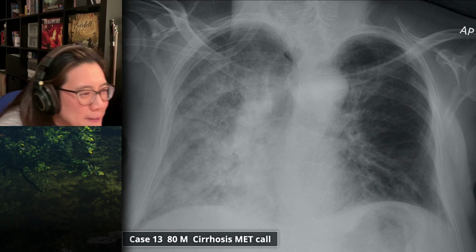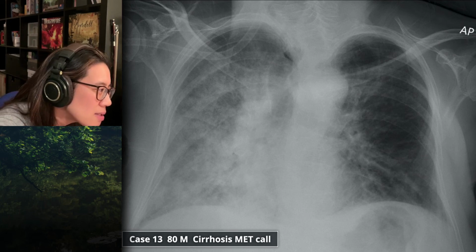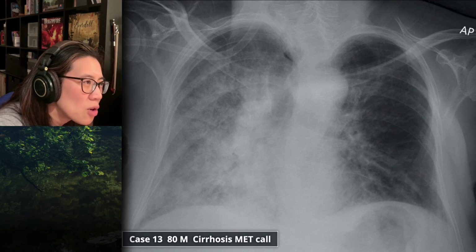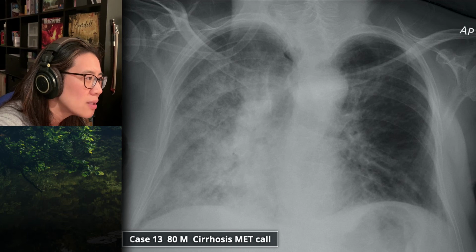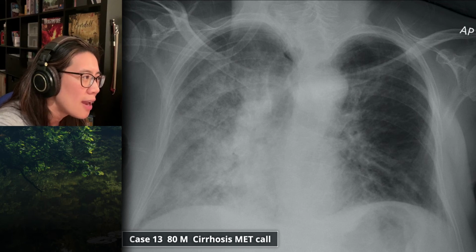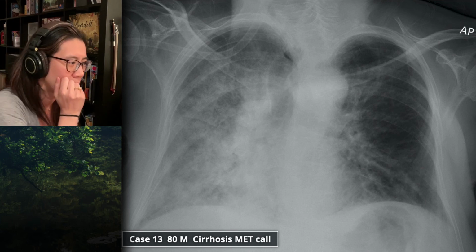Well, maybe I'm making it up. Whereas I can see some air bronchograms in the middle. Yes, there are air bronchograms, and there's no effusion and there's no pneumothorax. So I think this person has left ventricular failure, and I think that the reason why there's asymmetry, I'd want to know how the patient has been cared for. So is the patient lying on one side? So is this pulmonary edema that's come down onto the dependent portion of the lung, and now they've propped the patient up to take the X-ray, and he just goes back and lies on his right side.